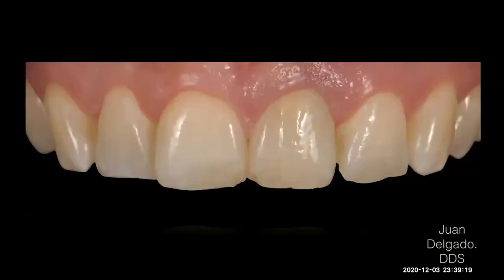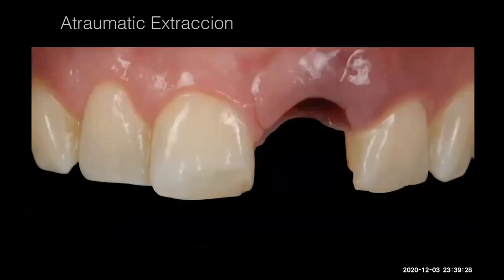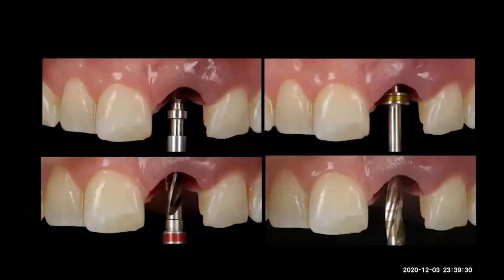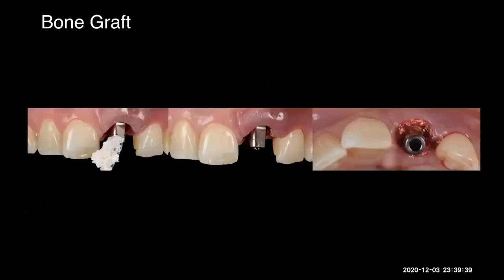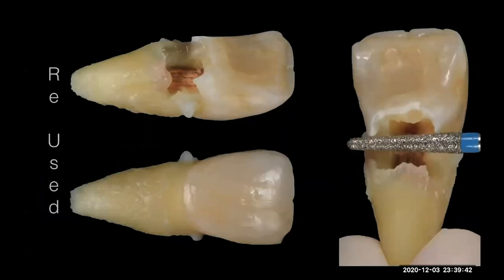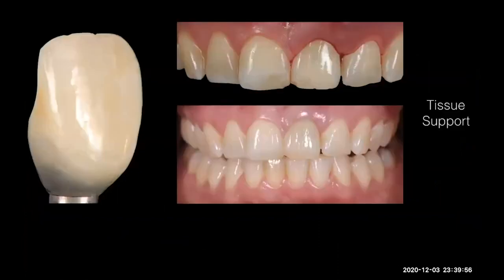This is another nice case, with resorption. This is from my friend Juan Delgado from Mexico. He did a nice job in the surgery with his surgeon. Clean protocols, clean procedures. He placed the implants and put in the bone graft. Then he used his own teeth as a temporary, which is the best temporary ever. Then he did the retrofit over his abutment, and then they let everything heal.